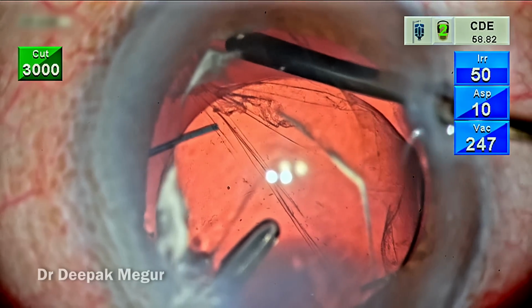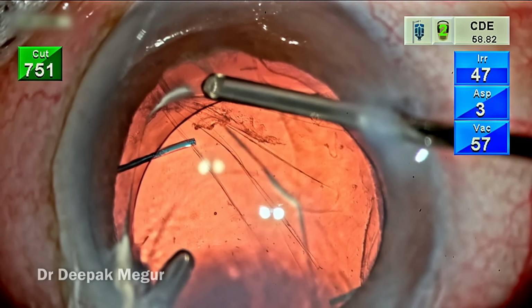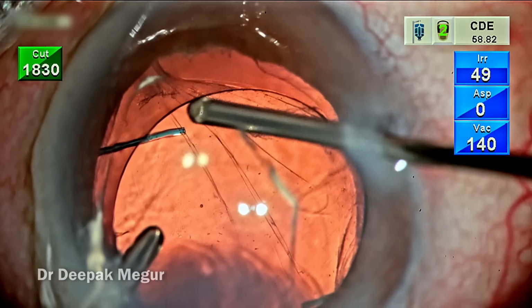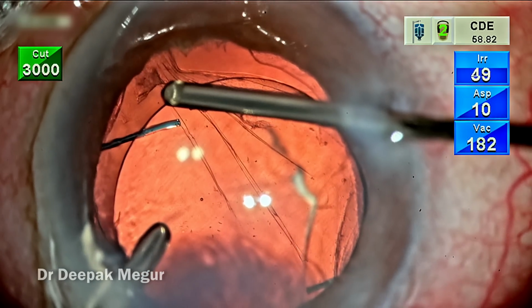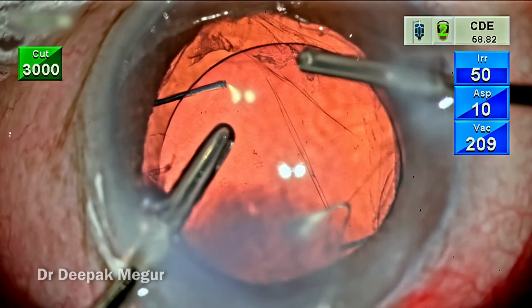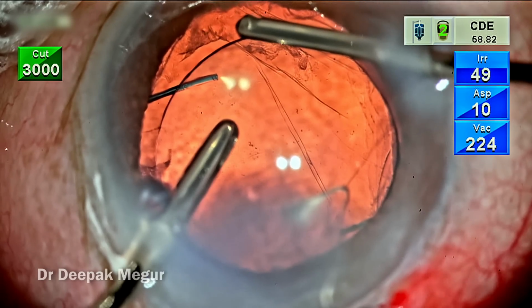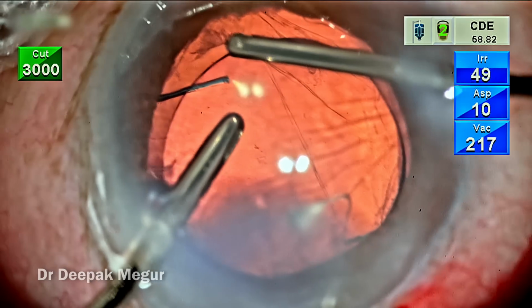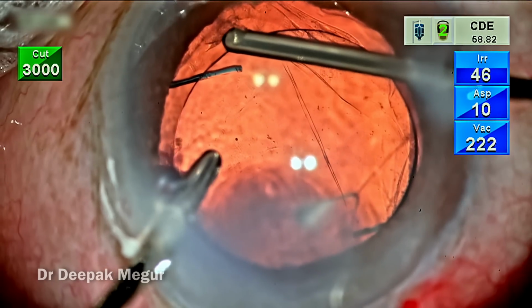So basically we have segmented the vitreous into two parts. The posterior prolapsed vitreous is first cut and the anterior prolapsed vitreous is now separated. Now finally the port is turned anteriorly and it's taken care of. So at this stage we can see the wrinkled posterior capsule unfolding now, and it looks like the tear is more towards the extreme right hand side.